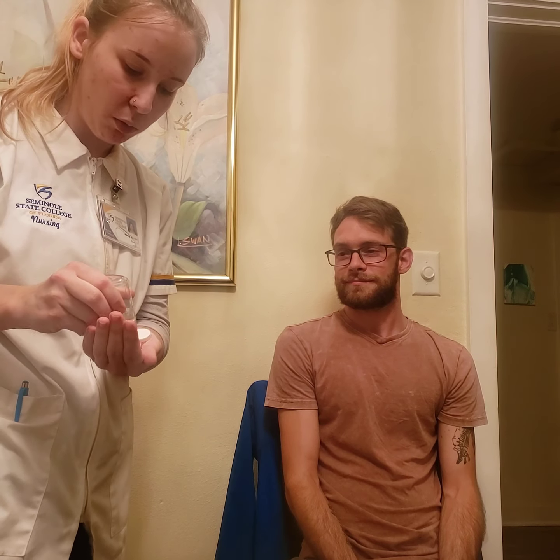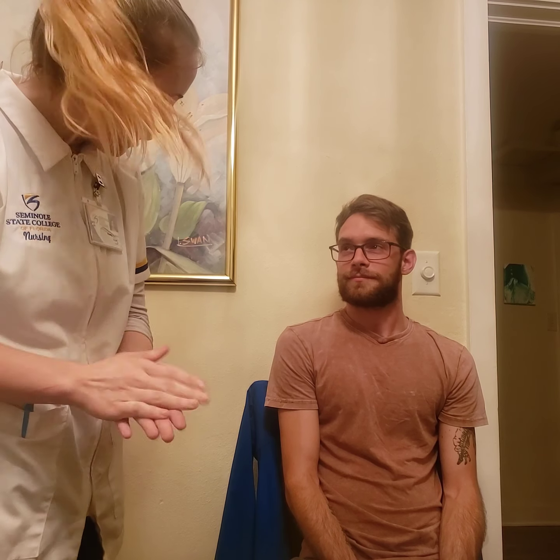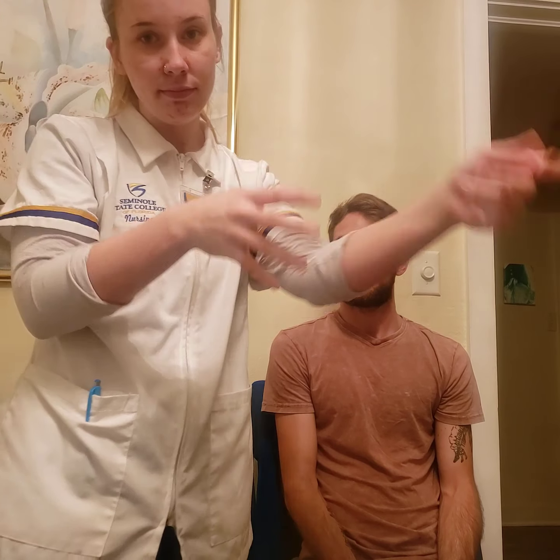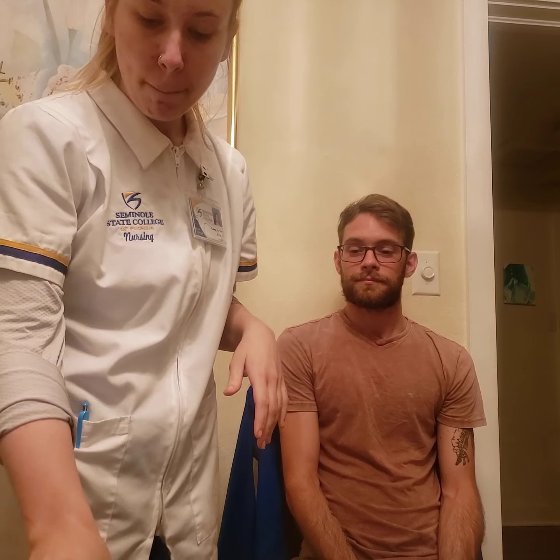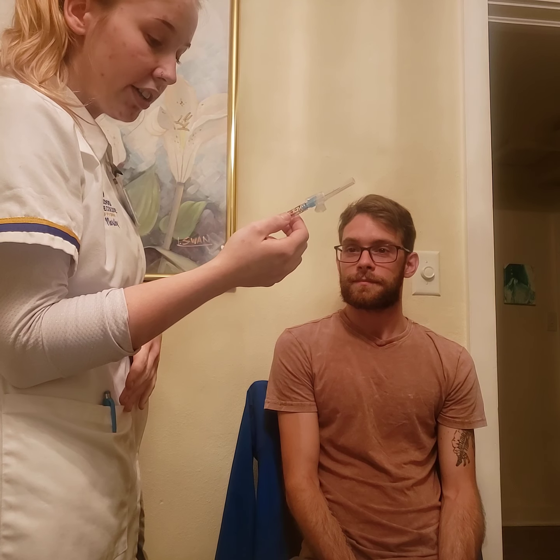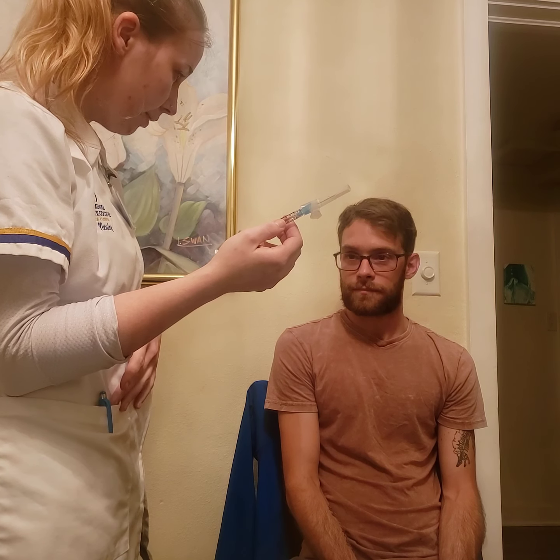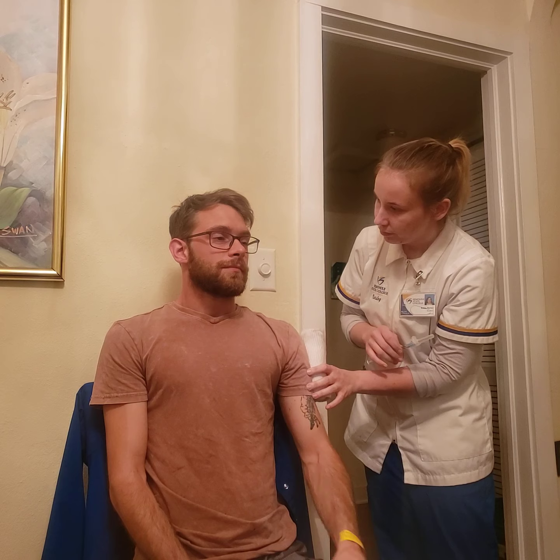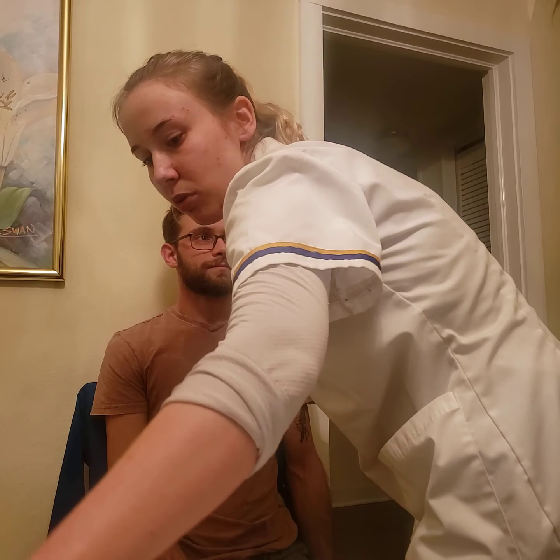Alright, so now that we've checked that, I've got my curtain closed, I'm gonna check one more time that you are Miss Anna Pawlowski. I am. And I'm gonna be giving you first your flu shot. I'm gonna don my gloves after doing my hand hygiene. So Miss Anna, I'm gonna be giving you your flu vaccine intramuscularly in your deltoid muscle. I'm gonna be giving it to you today at 1300, and it's ordered at 0.5 milliliters, okay? Okay. All right, so we're gonna go on your left side. All right, so I want you to try to relax your arm for me, okay? All right, let me get my swab here.